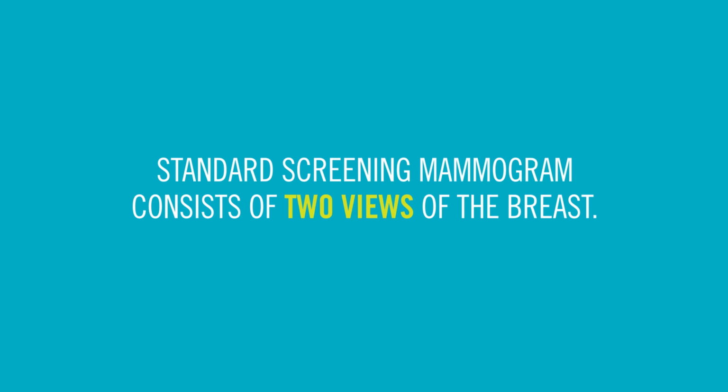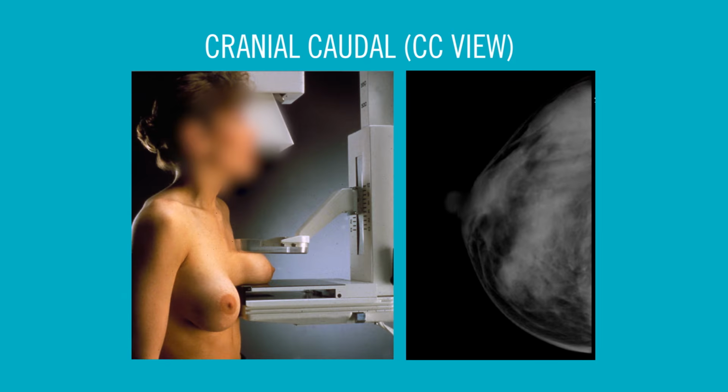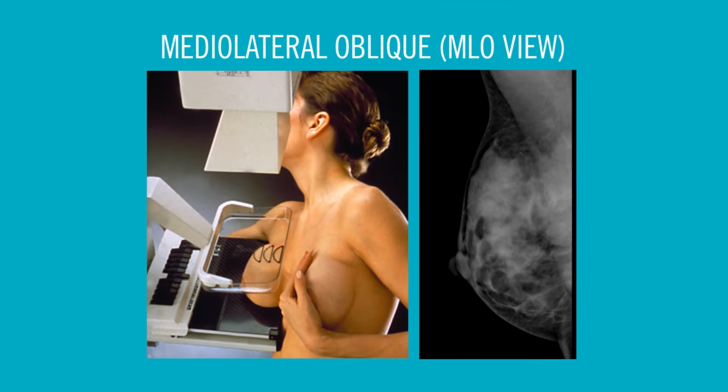The standard screening mammogram consists of 2 views of the breast and attempts to visualize all of the breast tissue: the craniocaudal, also known as CC view, and the mediolateral oblique, also known as MLO view.